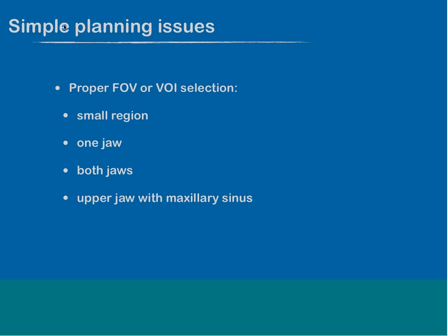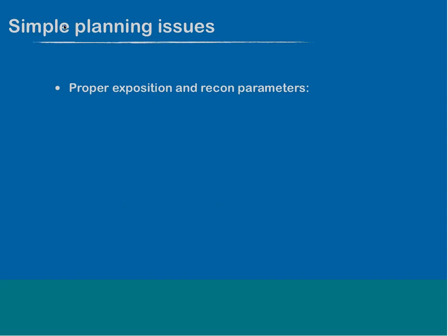I told you this is, from my point of view, conditio sine qua non when you want to prepare something for an external sinus augmentation. And finally, you have to look for some proper exposition and reconstruction parameters.